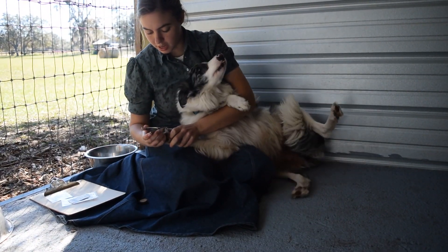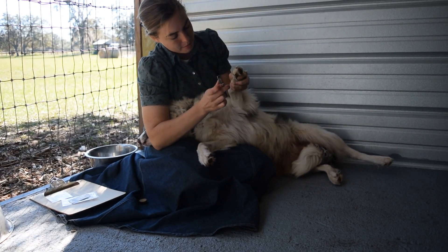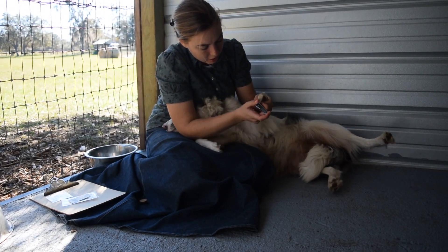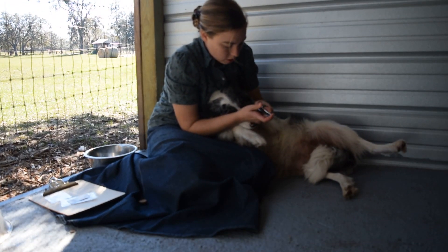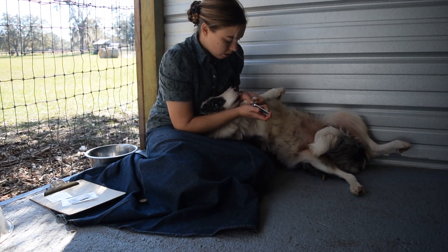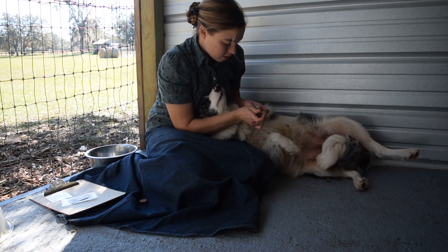Now some dogs you may not want to clip them this way with them laying in your lap, because some dogs will get quite frightened and may even nip or bite. You certainly don't want to risk that. But I know that I'm safe here — she may try to get away from me because she doesn't like having her toenails clipped.